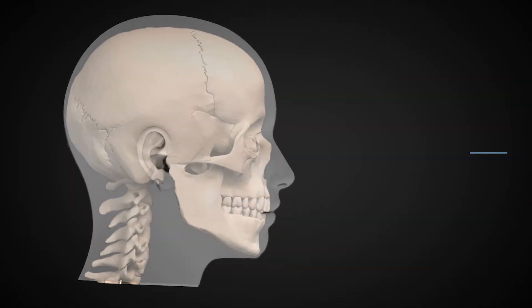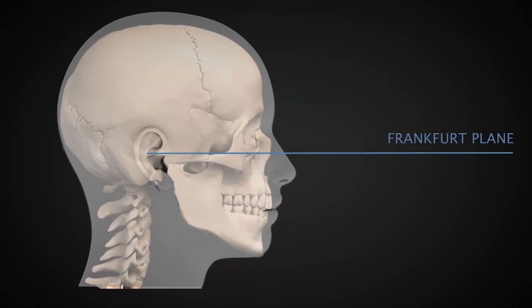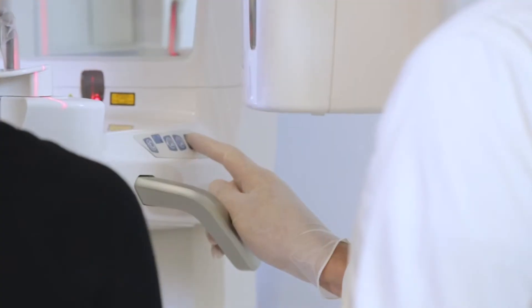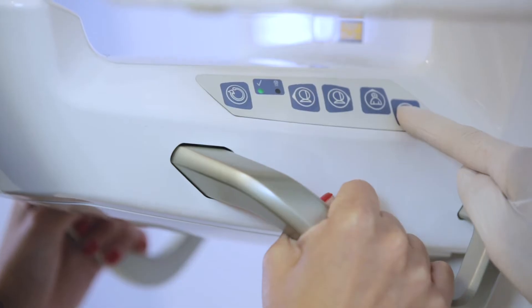To adjust the head tilt angle and obtain the correct positioning of the Frankfurt plane, the dentist uses the up and down keys and the wheel to adjust the height of the laser.